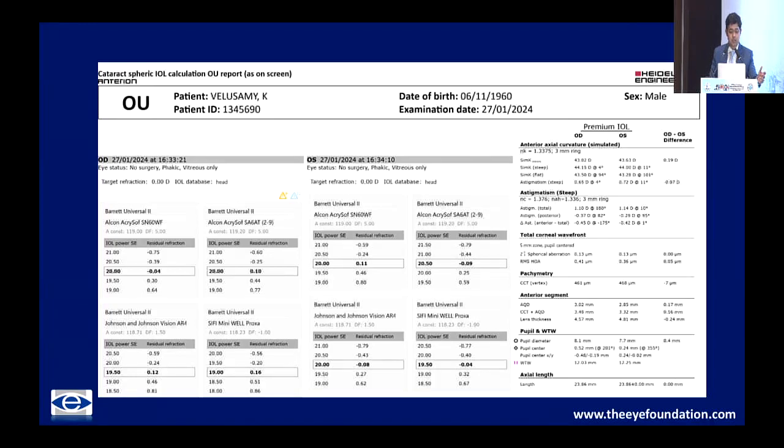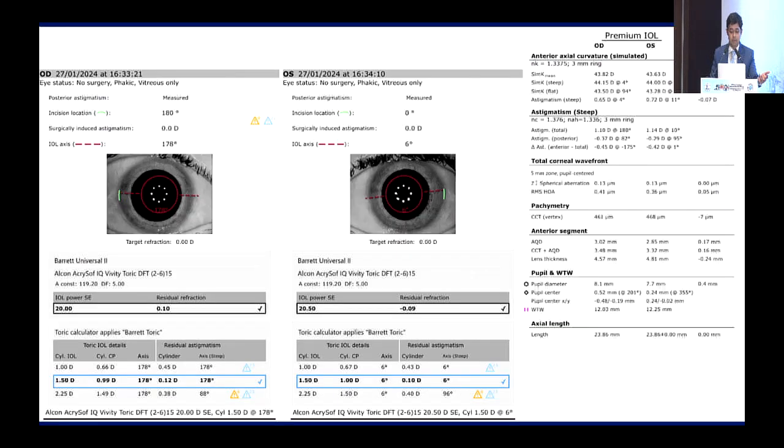Within the same device, you also have various formulae which can be entered, and different types of IOLs which can be entered, and you get the accurate biometry data.